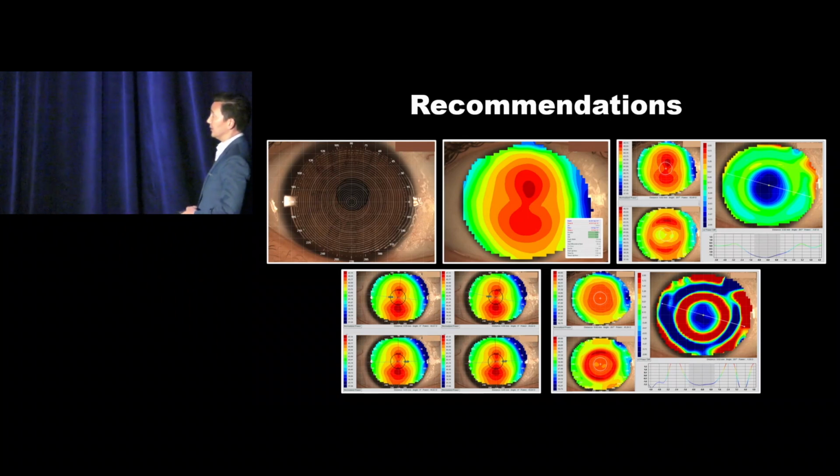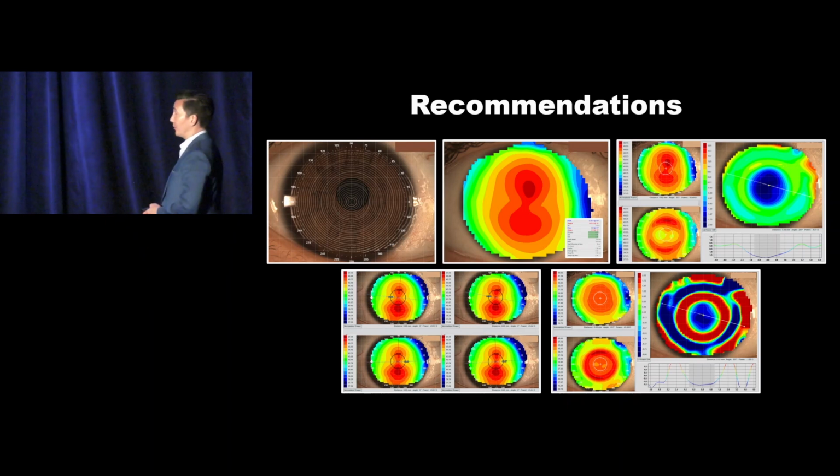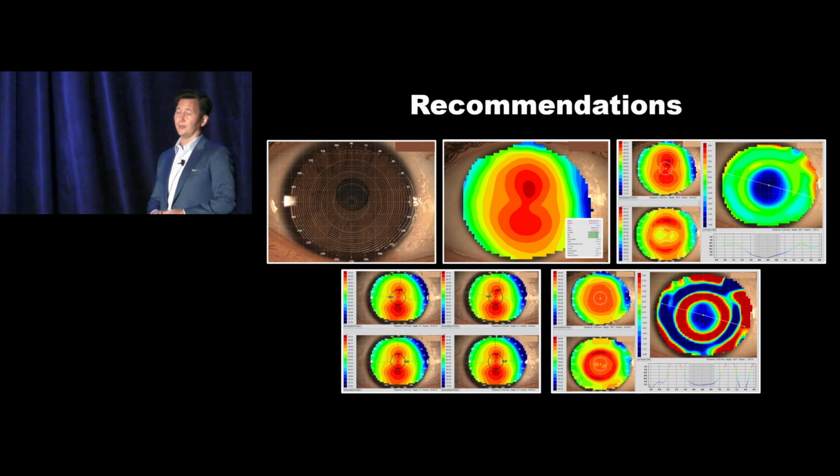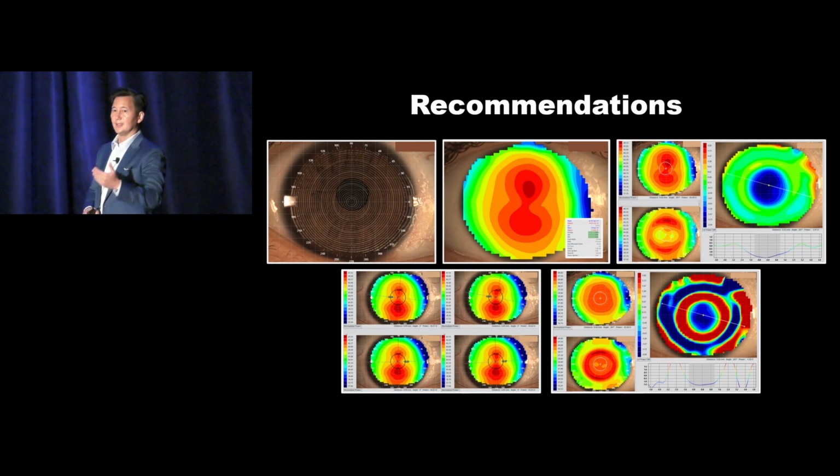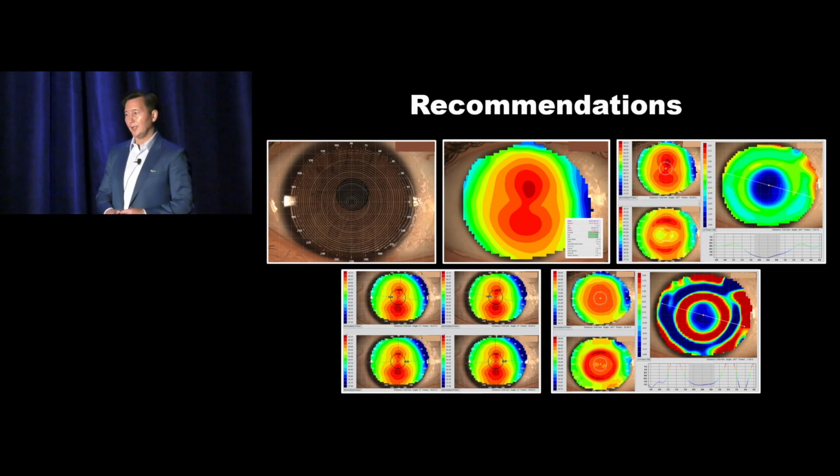So just to close up this session, some of the recommendations that I highly encourage, and this is also referring to our morning session: make sure you've got good quality baseline topography. It's so important to your success going forward. Spend the quality time training whoever's going to do the maps. Make sure they understand how to take wicked good maps. That's one of the things.